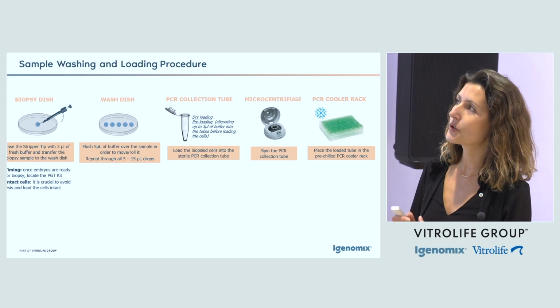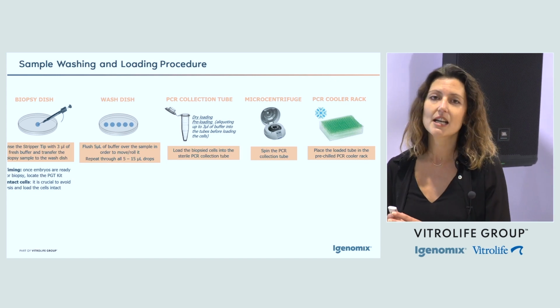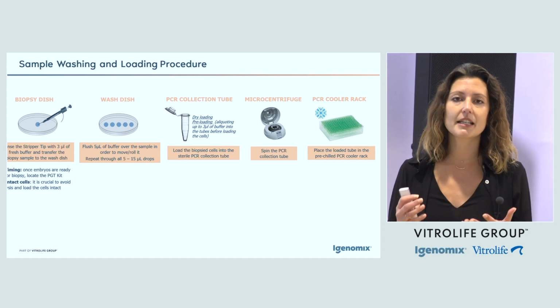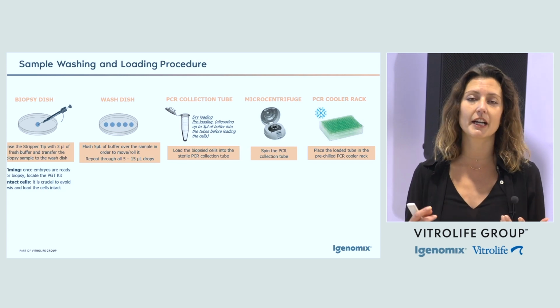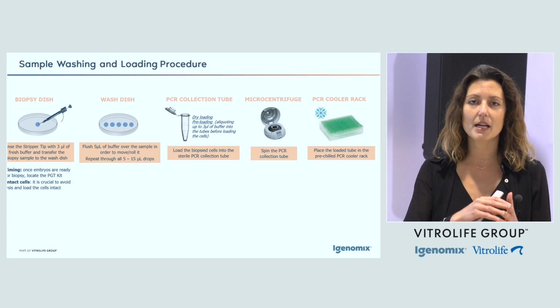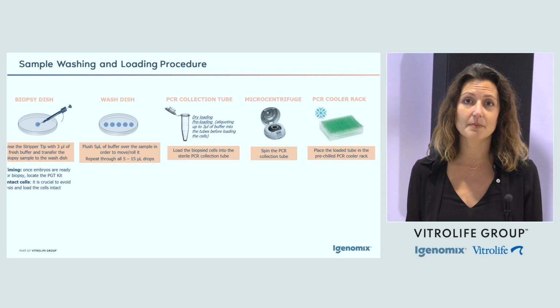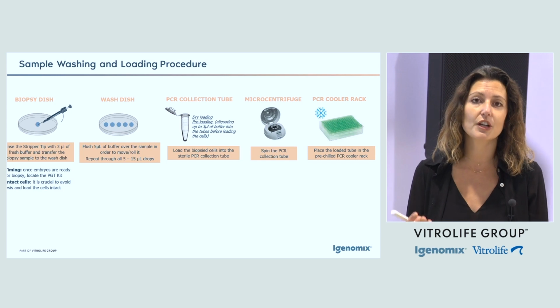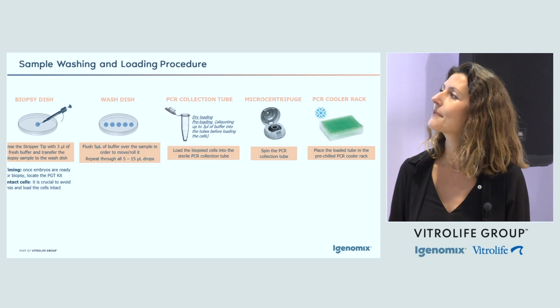The second thing that is crucial in this first step is to have intact cells. So if there was any kind of lysis during the biopsy because of the laser or the flicking method or anything else, that's something that we don't want within the tube, because that could mess with the diagnosis. It might have an effect, for example, in an increased rate of mosaicism results.